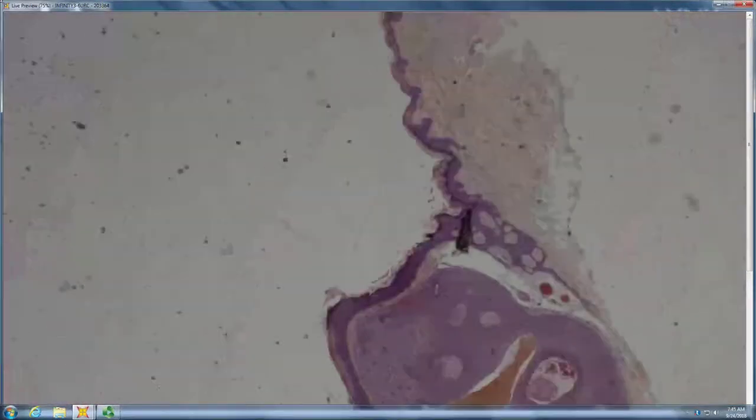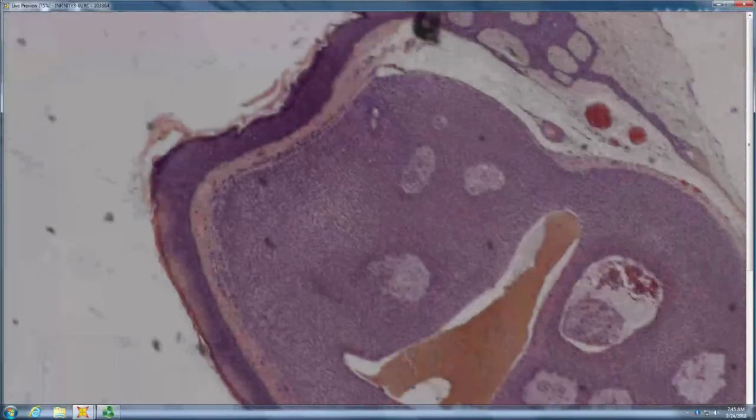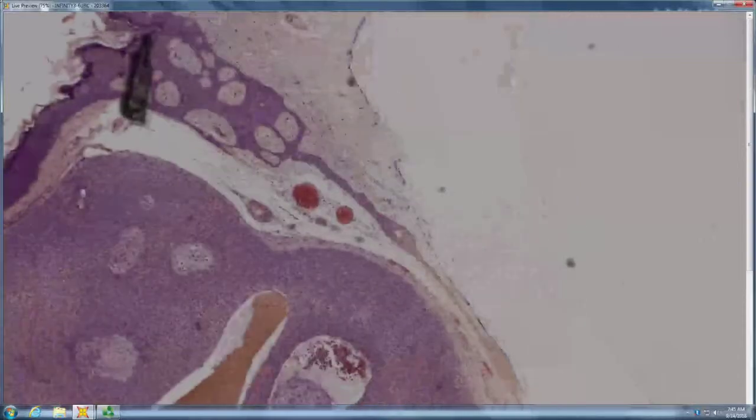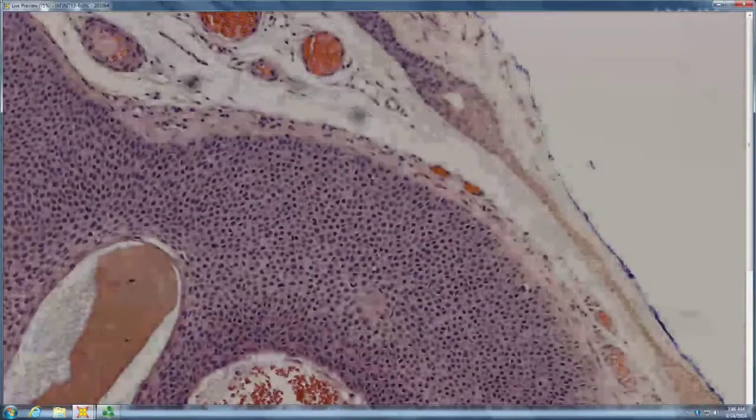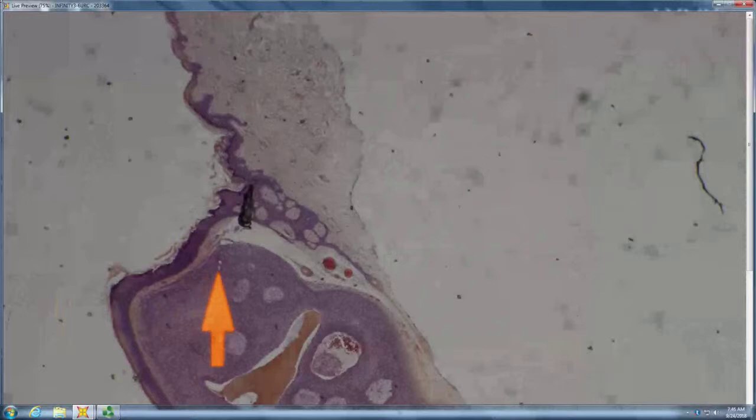Looks like you have a clear cell proliferation hanging off the epidermis. Trying to see if it palisades or not. I don't think it does. I agree with you. I don't see any palisading at all. So something in the acrospiroma group, and you said hanging off the epidermis, this little duct there. So pretty good for poroma, but definitely something in the acrospiroma group.